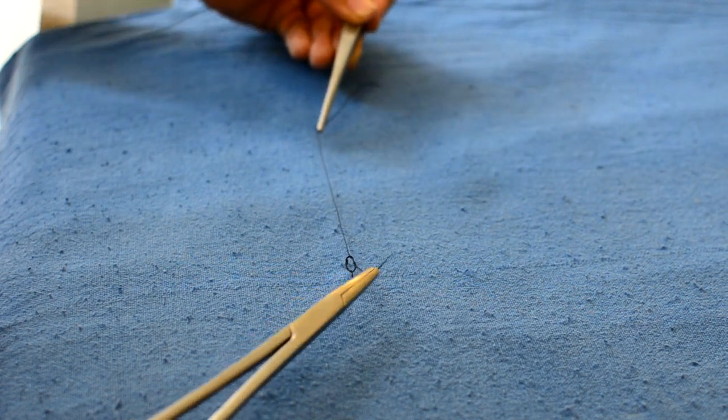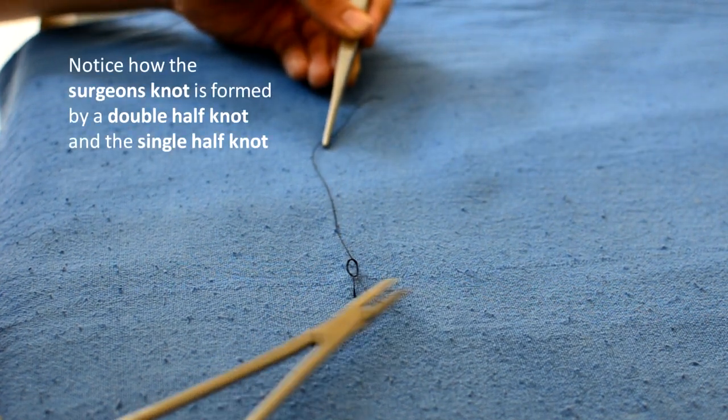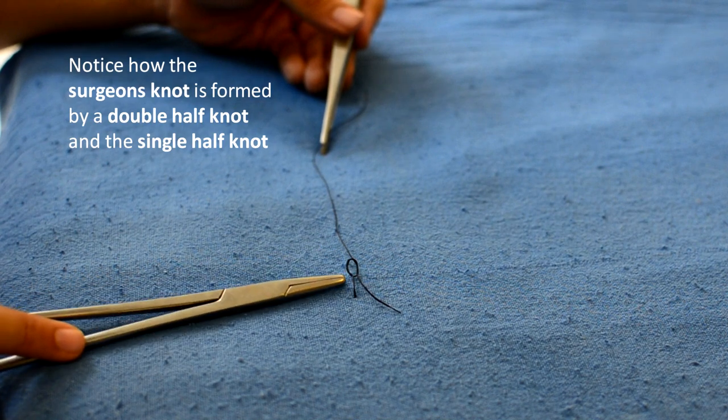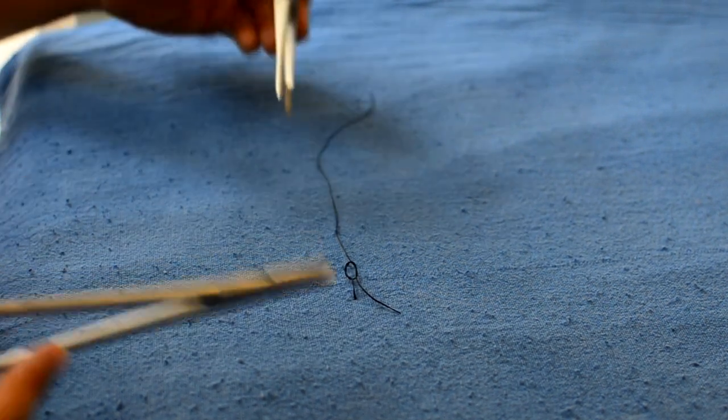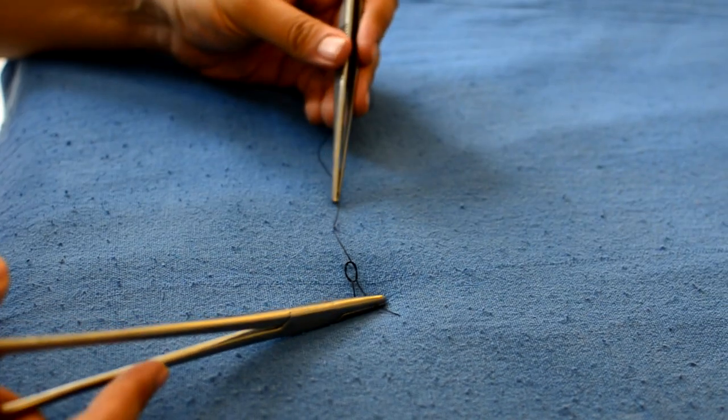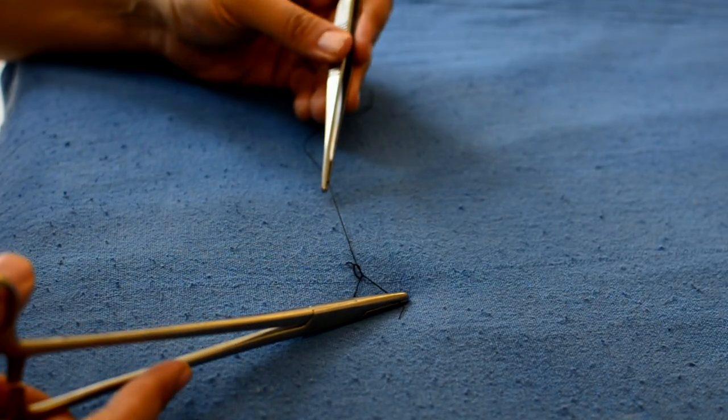Here you can see that it's a surgeon knot which is being formed by a double half knot and a single half knot. We can now pull it out and tighten this knot.